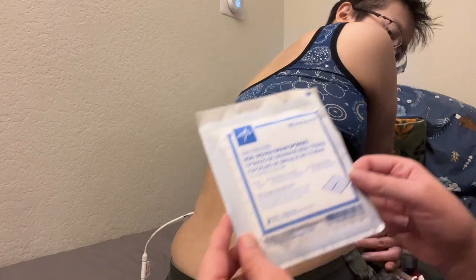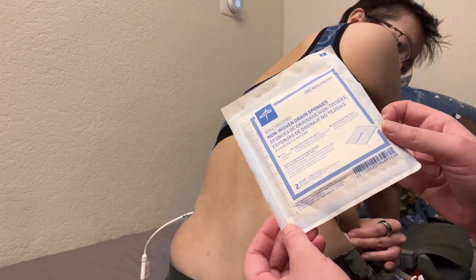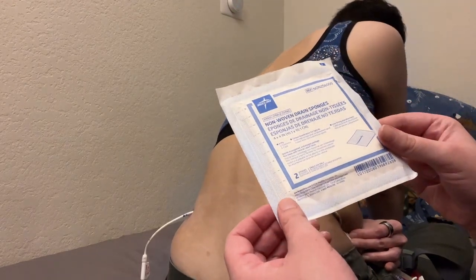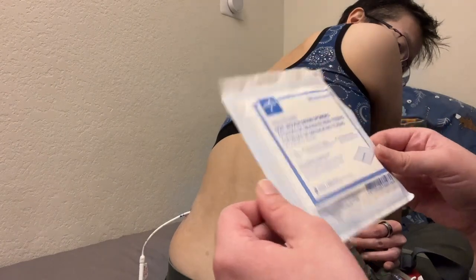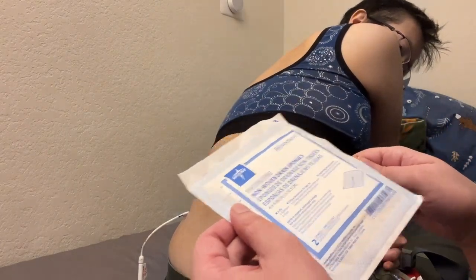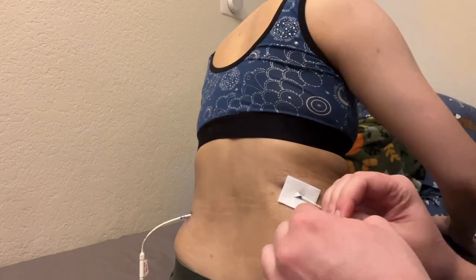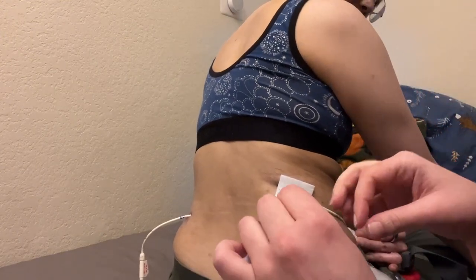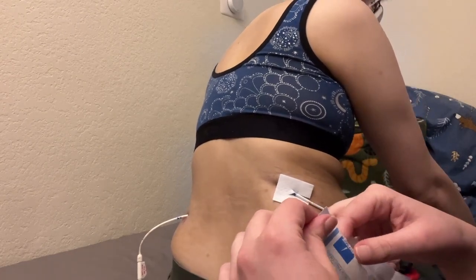The next part I'm using is a non-woven drain sponge, 4x4, but you can use any kind of dressing you want to cover it. This particular product doesn't matter; it's entirely personal preference. Gauze is a thing you could use here if you wanted.